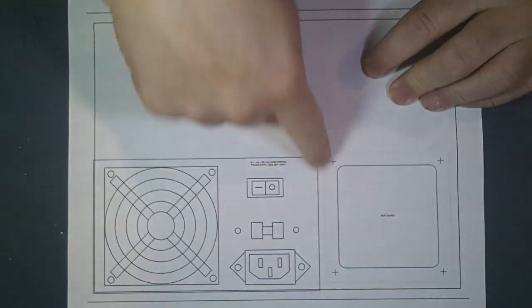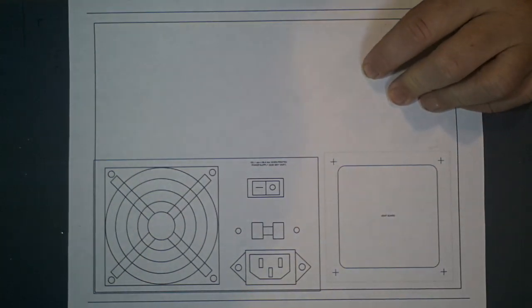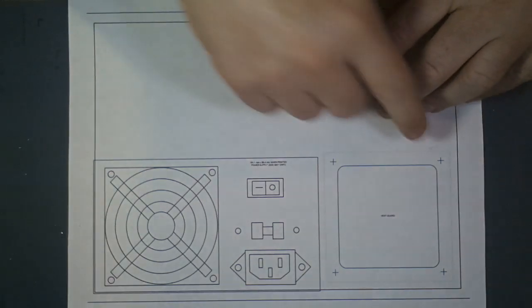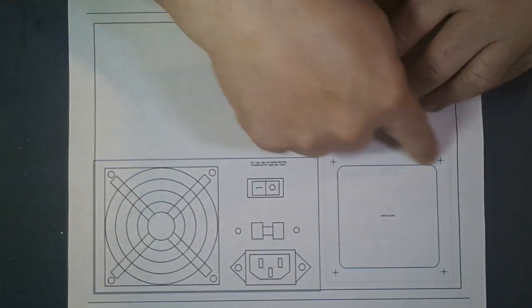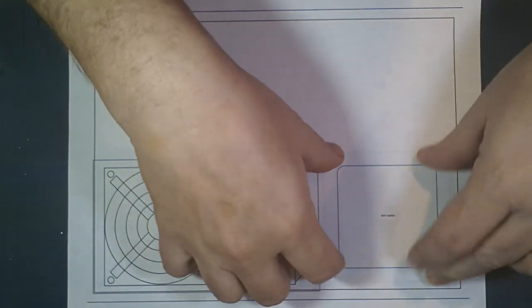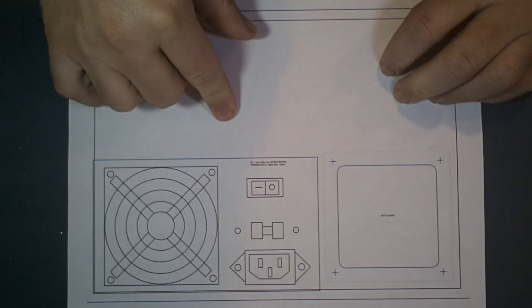I have these little metal screens. I bought a couple of them. The company supply store that I used to get into a surplus went out of business. So what you can do is you can just get some screen from, like, garden or a window screen, and put it on the back of this and screw it in place with some washers. And that would make a nice vent hole.